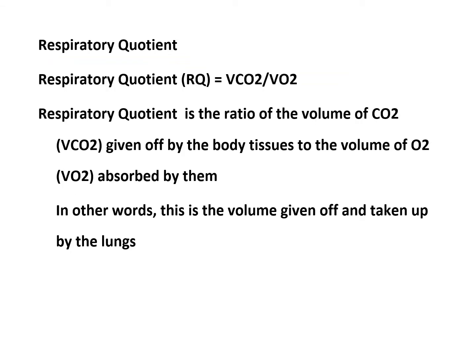When we're looking at the respiratory quotient, it's VCO2 divided by VO2.